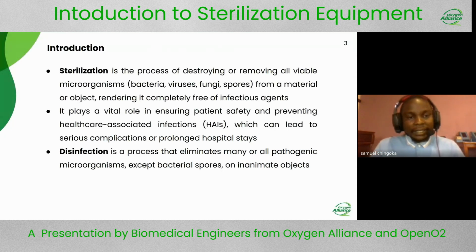Sterilization is a process where we want to eliminate all viable microorganisms, which are bacteria, viruses, fungi, or spores from a material or object, rendering it completely free of infectious agents.